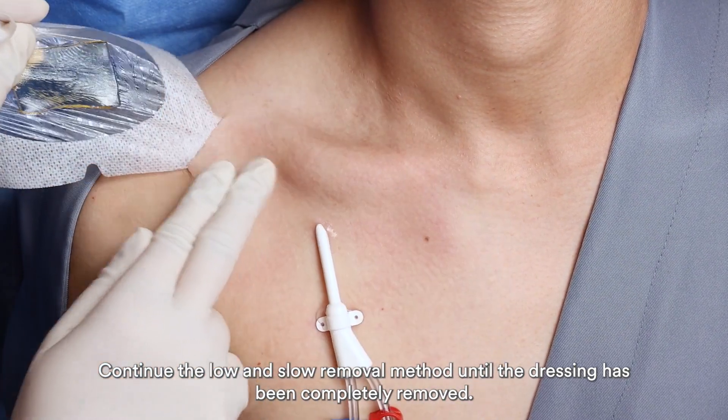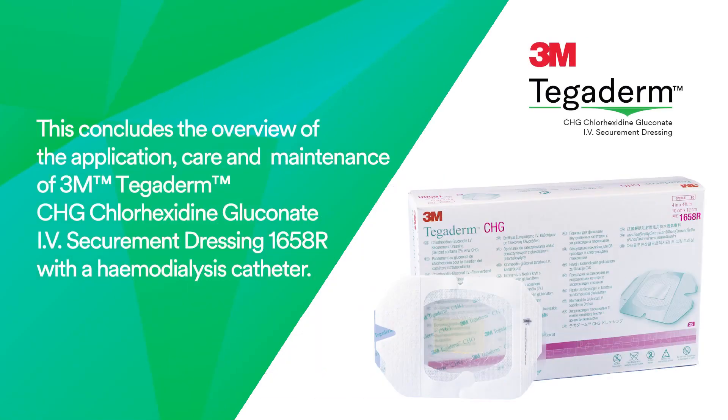This concludes the overview of the application, care, and maintenance of 3M Tegaderm CHG Chlorhexidine Gluconate IV Securement Dressing 1658R with a hemodialysis catheter.